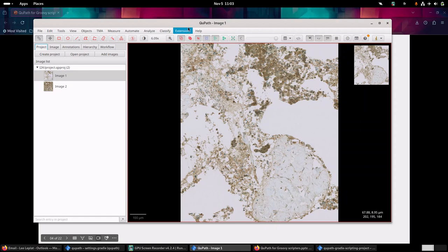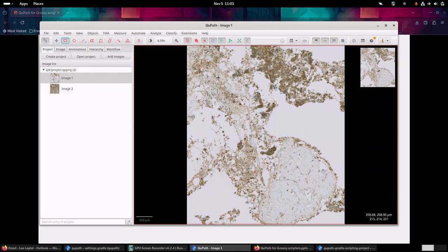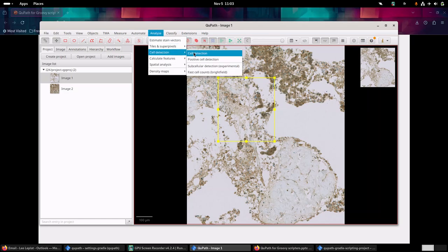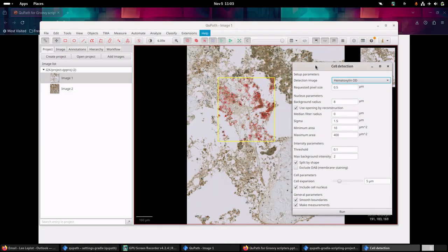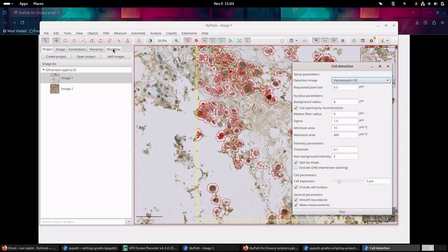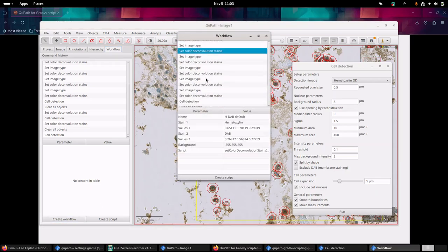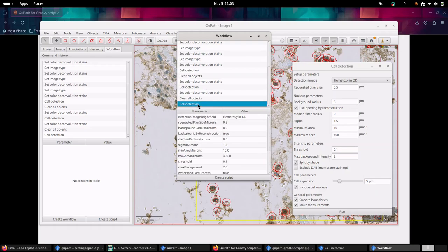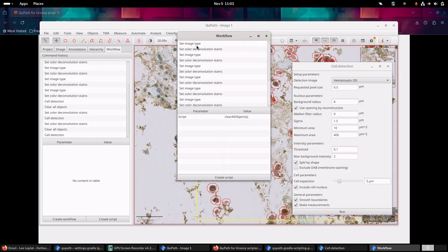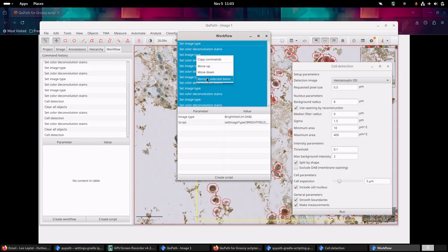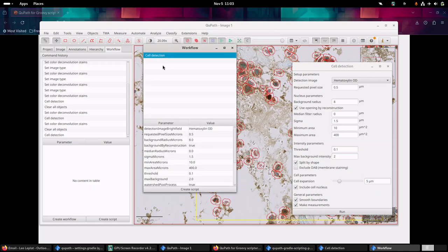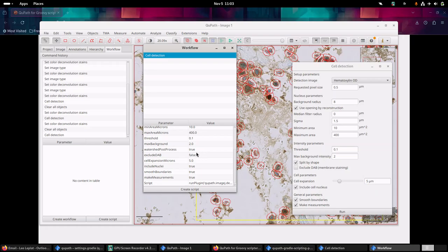So here I have QuPath, I have an image, and let's say I want to create an annotation and then apply a cell detection algorithm. I have some cells here, and if I go to the workflow tab on the left panel, you see that there is a history of everything that happened. From that, you can click the create workflow button and you see that we have a lot of steps. Let's say I want to only keep the last one - the cell detection. I will select everything else, right click, and click on remove, and then I just have this cell detection step, which contains all of the parameters I used during the detection.